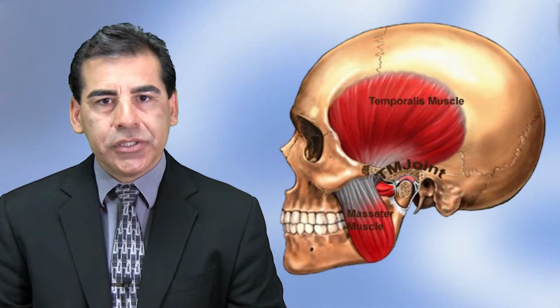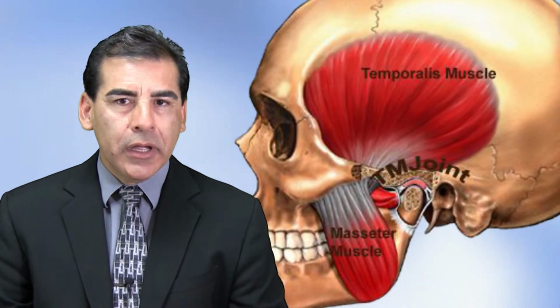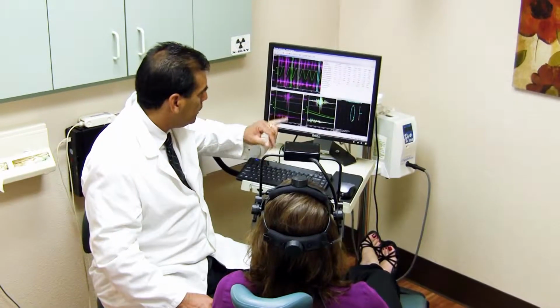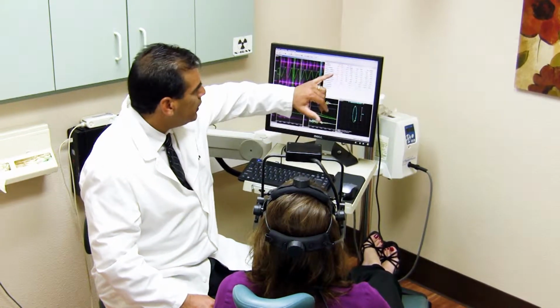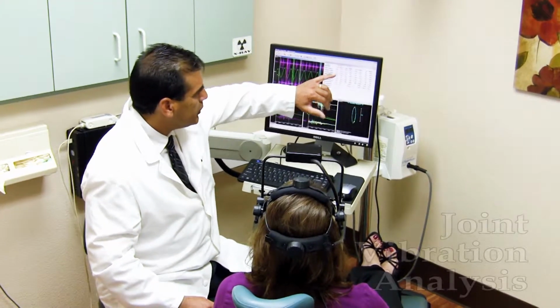The computerized bite analysis is combined with electromyography to evaluate muscle activity of the temporalis, masseters, digastrics, and sternocleidomastoids during various tooth functions. This gives definitive biometric information to find if a patient's bite is causing these muscles to be overworked, and gives me real-time evidence-based data to help find which treatment will allow these muscles to relax, thus allowing the patient some relief from their painful symptoms.